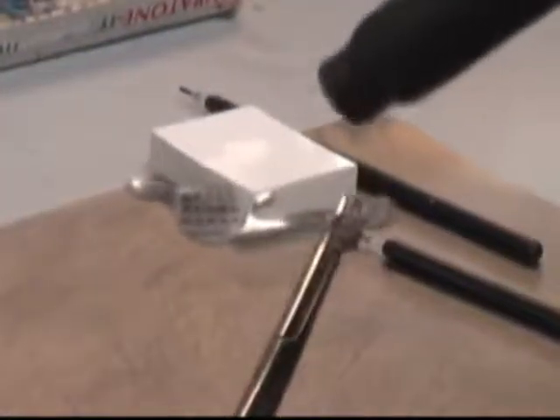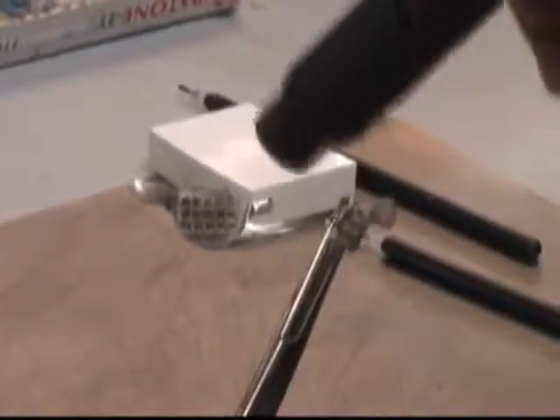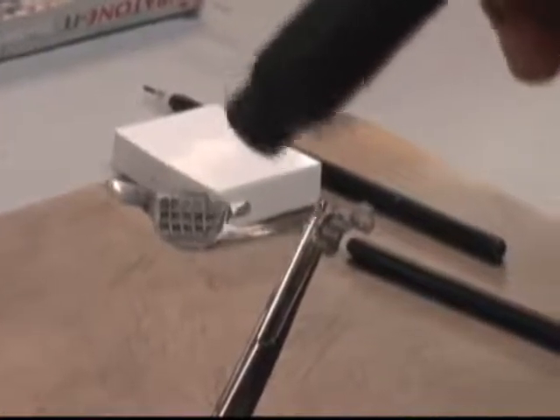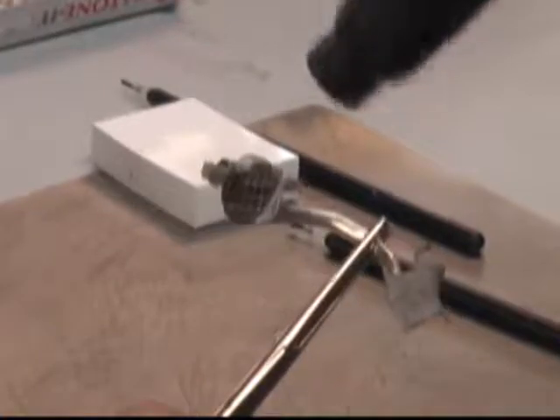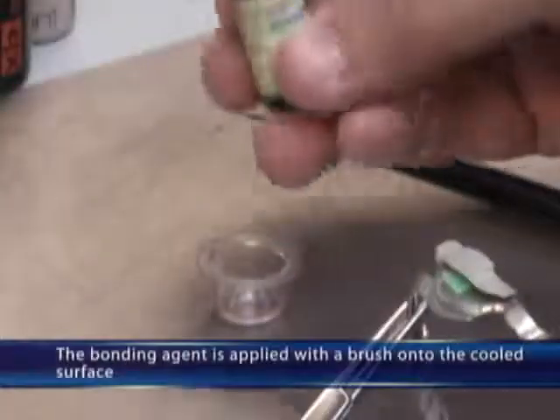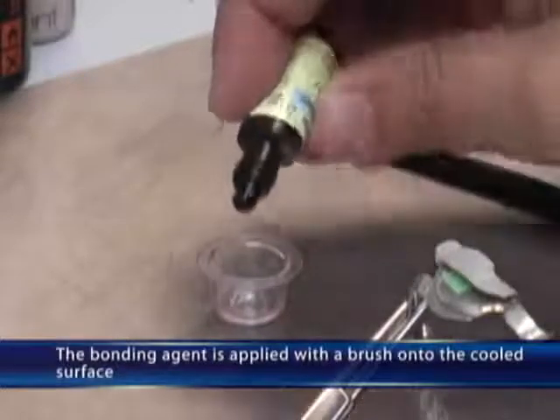It has never been easier to produce gap-free and reliable chemical bonding of metal-to-resin, ceramic-to-resin, and resin-to-resin. This is due to the special Solane gas mixture and bonding agent. The bonding agent is applied with a brush onto the cooled surface.